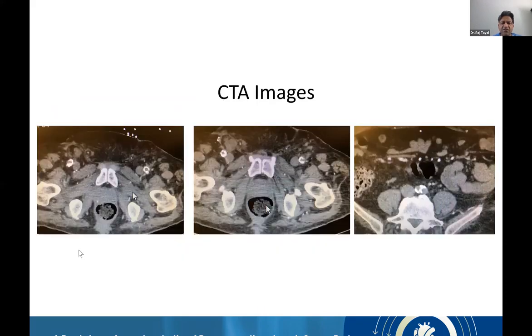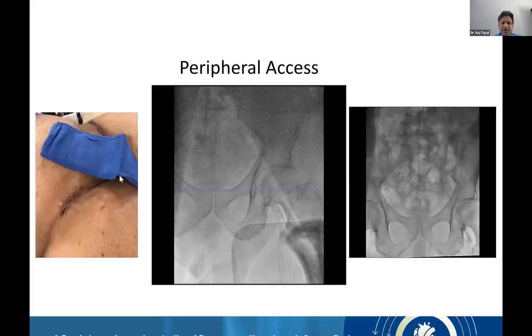The CT angio was obtained quickly as the patient was being evaluated by surgery and consideration for a valve procedure as well. You can see there are diffuse rings of calcification all throughout the iliacs down to the femorals and basically throughout his body. You can see it was a very inhospitable groin. However, he did have stenoses at the ostium of the left subclavian on CTA as well, and then was found to have diffuse disease elsewhere.